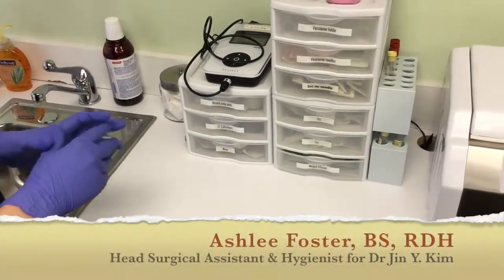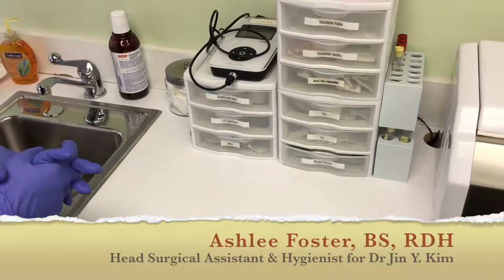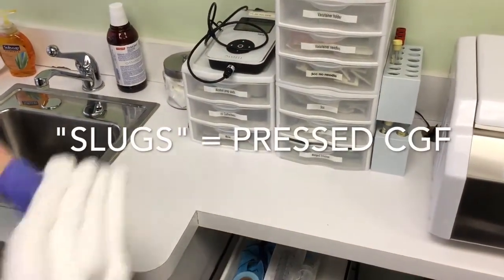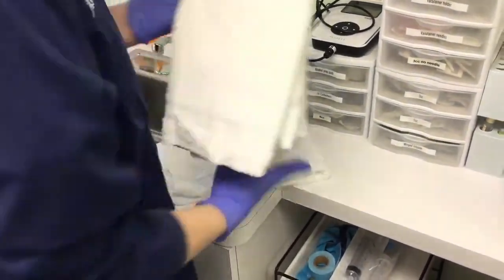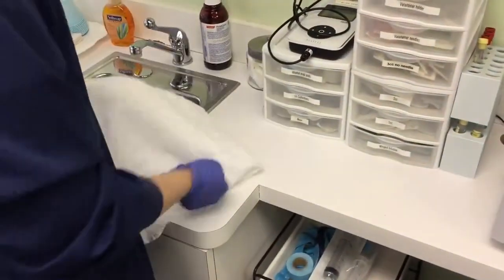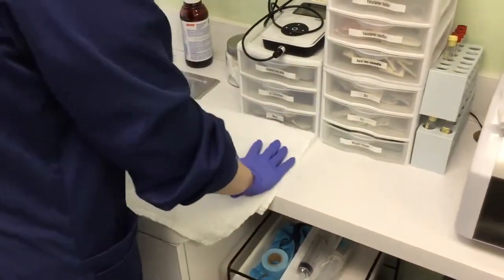Today we're going to be showing the setup for blood draw for CGF. I start with four white towels. I take one to begin with and stack the others off to the side. This first towel I fold in half and leave it right here on the counter.